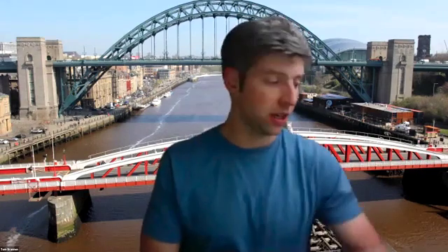It's a controlled liquid in the UK. I've got some from an old endodontist, Jeff Seckham, who kindly gave me about 10 litres of the stuff. But you can get it from some suppliers. I'm not sure where, so I've got big jars of the stuff. I know other people use eucalyptus oil or some sort of orange solvents as well. But chloroform, if you can get it, it's great.